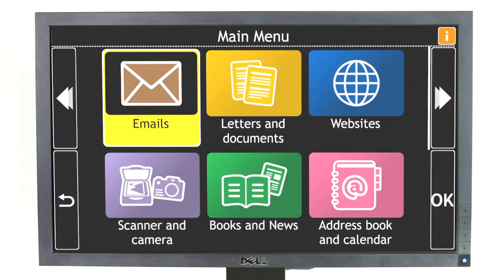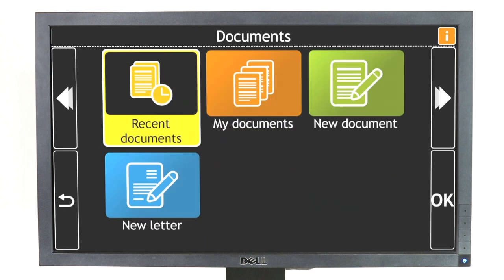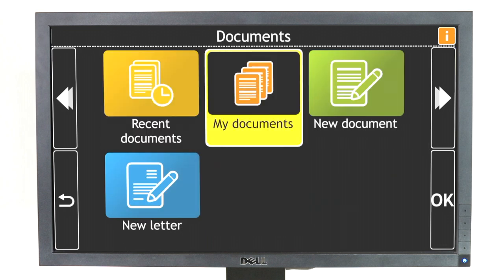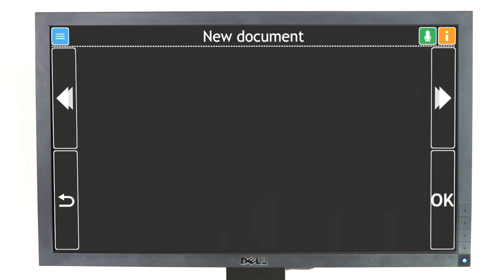To use Voice Input, first open a document or email in GuideConnect where you can type text or numbers with your keyboard. GuideConnect will announce: "New document, please type your text, voice dictation is available."